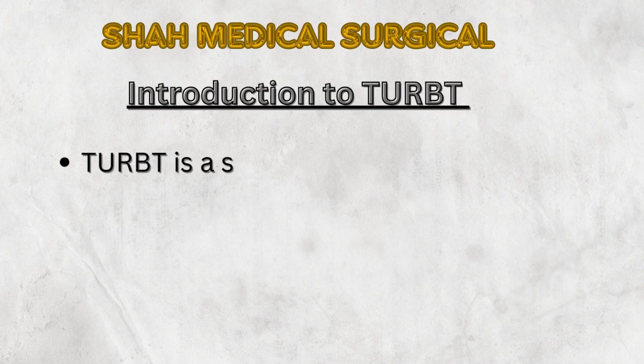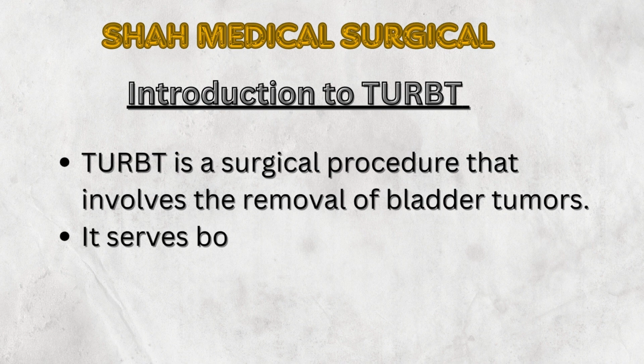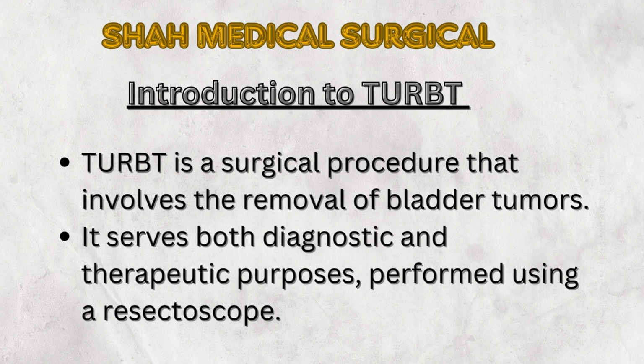TURBT is a surgical procedure that involves the removal of bladder tumors. It serves both diagnostic and therapeutic purposes, performed using a resectoscope.